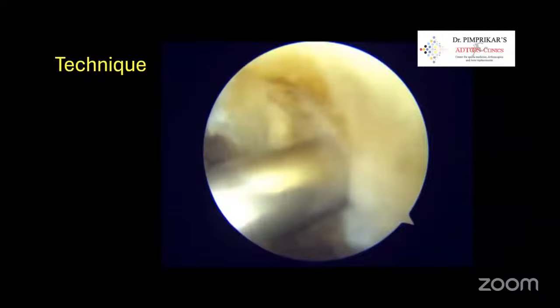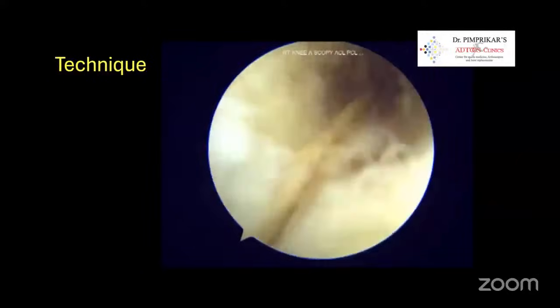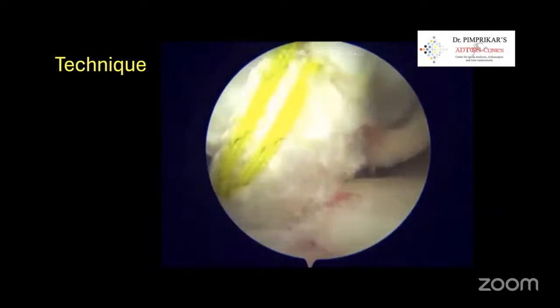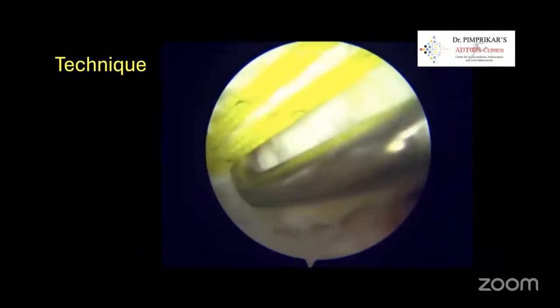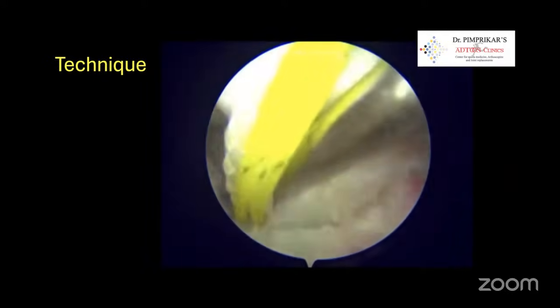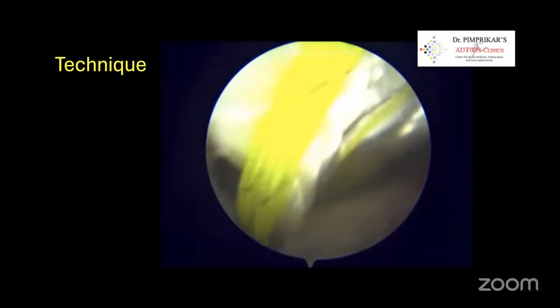Now that's the shuttle which you can see, and that's a single suture. So here one can use a Wissinger rod from the posterior medial port to avoid the killer turn and aid the graft to slide into the femur easily. And the other way to do it, one can use a probe from the anterior port, which you can see here, and you can lever these sutures out with the endo button. So this gives you the same principle of levering the graft inside the joint.